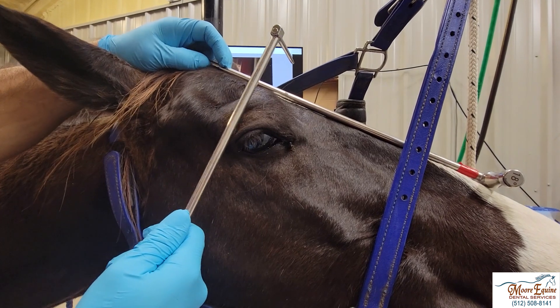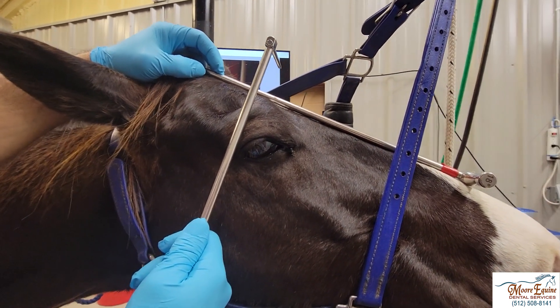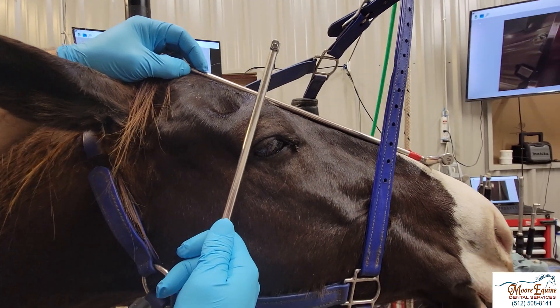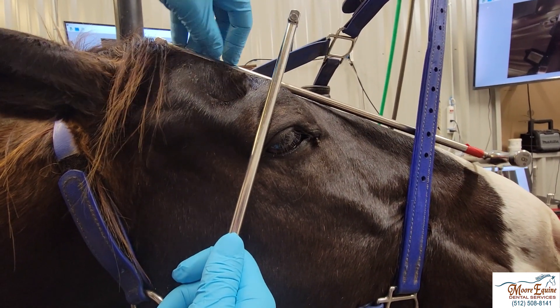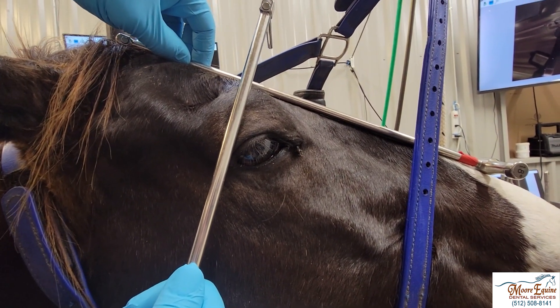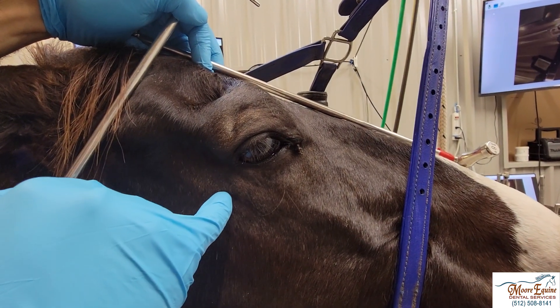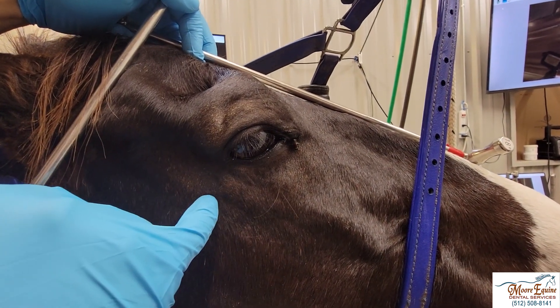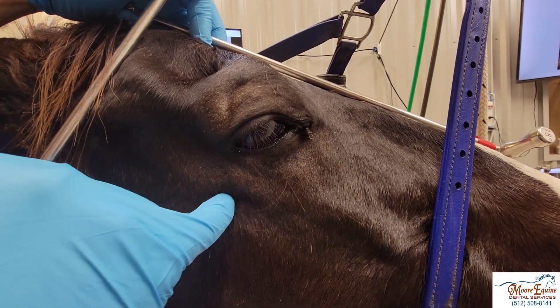We put an elevator along the frontal bone, and going through the lateral canthus we come around and show it from the side. You can see how both elevators are 90 degrees to each other through the lateral canthus of the eye. We're going to go about a centimeter or so underneath the facial crest right there under that lateral canthus, and go all the way in until we hit bone.